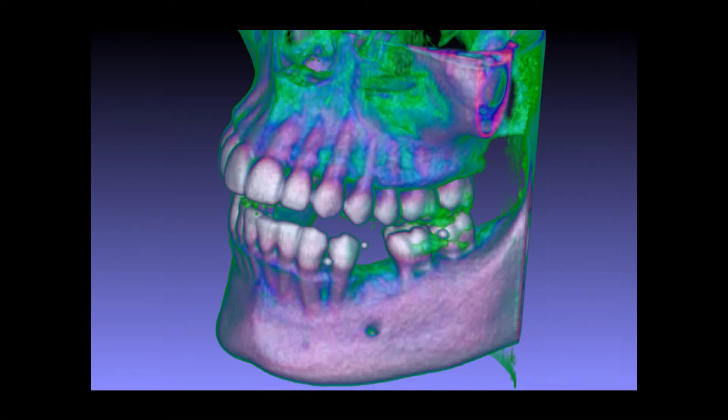This demo series uses a couple of DICOM data sets to demonstrate the system functions, including segmentation, STL generation, and additional visualization options.